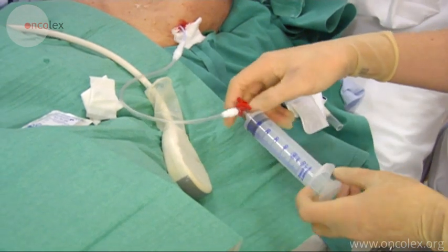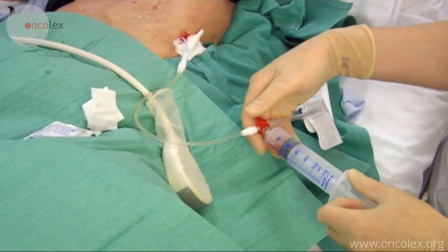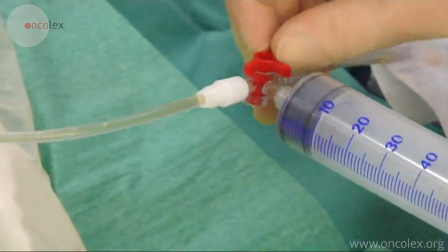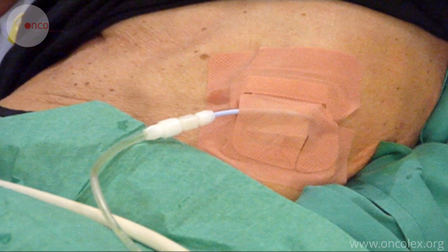Flow is checked by aspirating with a syringe. The puncture wound and catheter are bandaged.